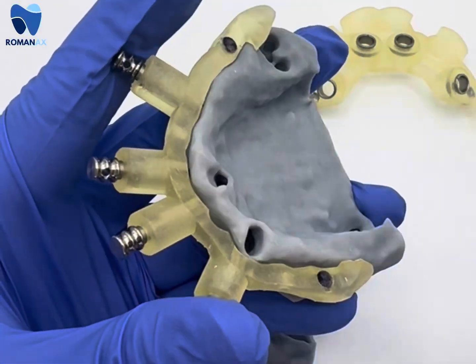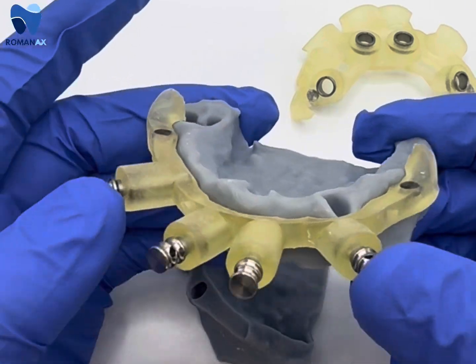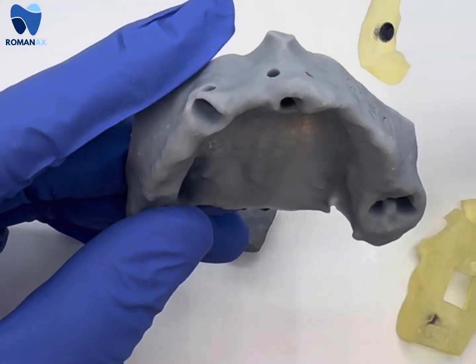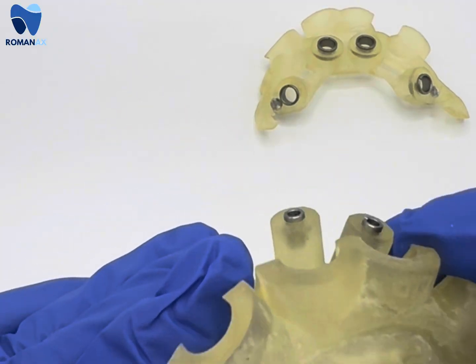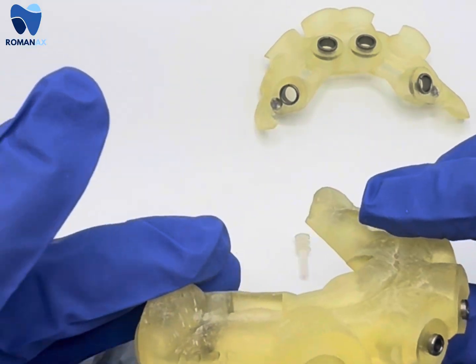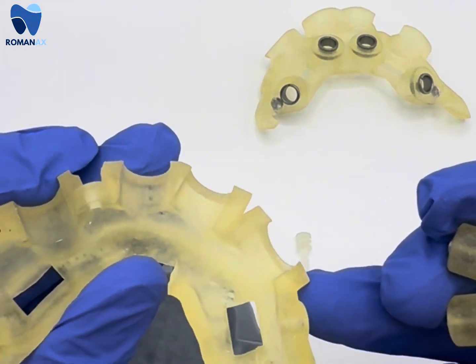In this video we're going to be going over a bone reduction and a tooth-supported pin guide. Here we have our model that has the extracted teeth, and since there's not enough teeth to get a good stable pin guide that's tooth-supported, we went ahead and opted for a bone-supported pin guide.